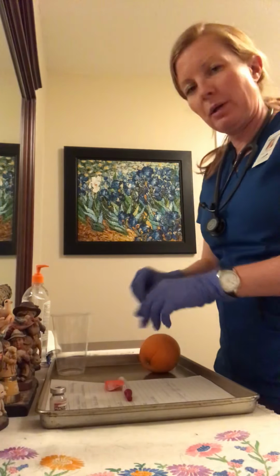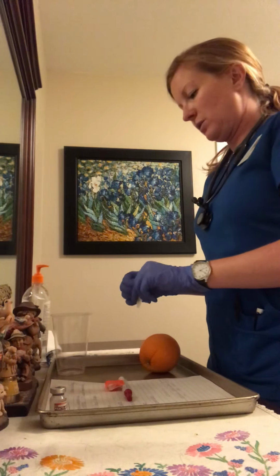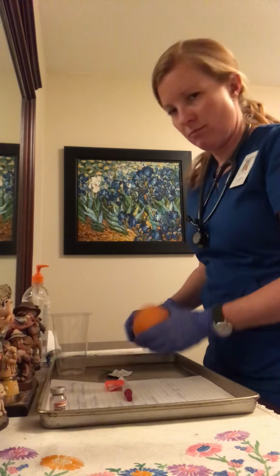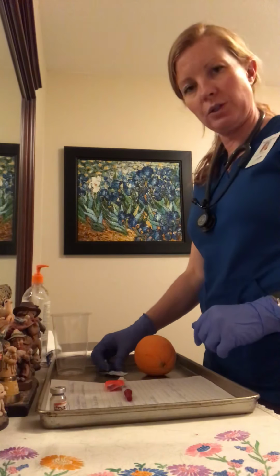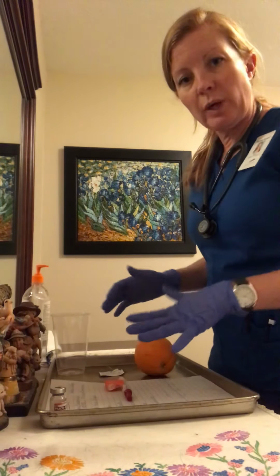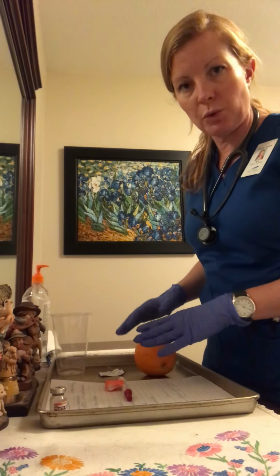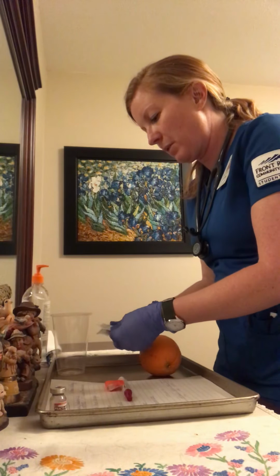I'm going to open up my alcohol and select a site. This orange is looking really good tonight, so this will be our location. For heparin, you can only inject it in the abdomen, so that is our only choice. So here's my abdomen. So I have my alcohol swab.